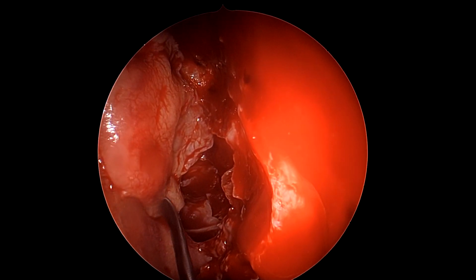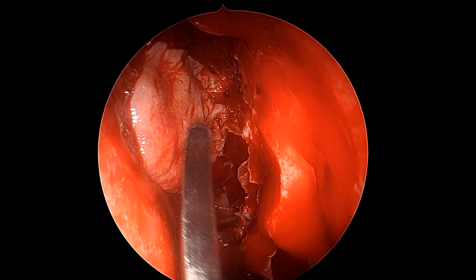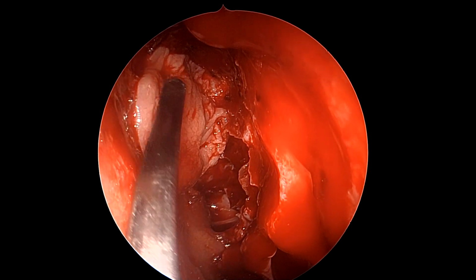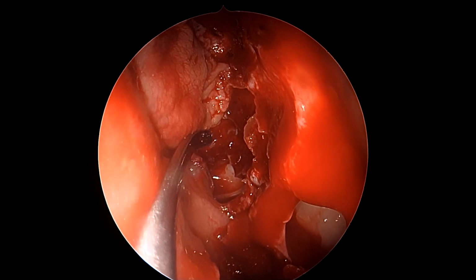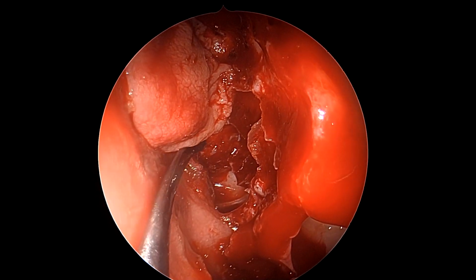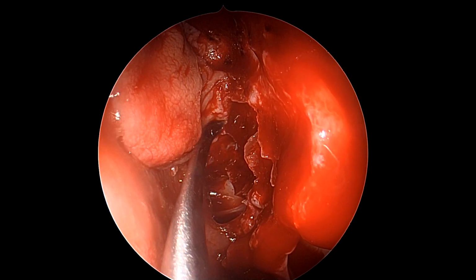So as you see, we have covered that part of it, which was where the fat was protruding, with some fascia being in the back. That is all right. And again, we tuck it, see that there is no air or blood inside it, palpate it from all sides. And once that is done, then we can resort to using the tissue glue on this assembly.